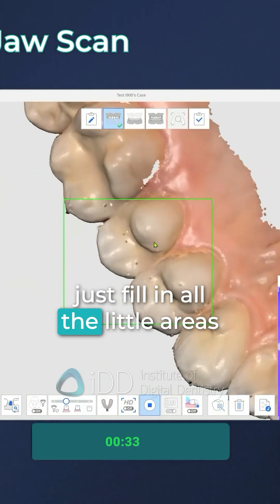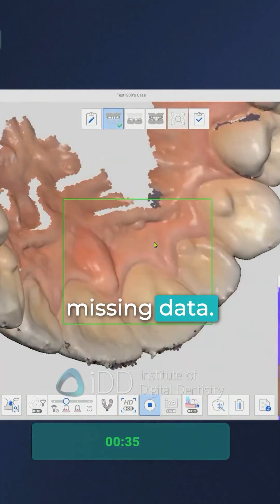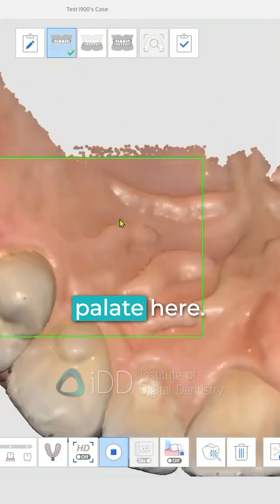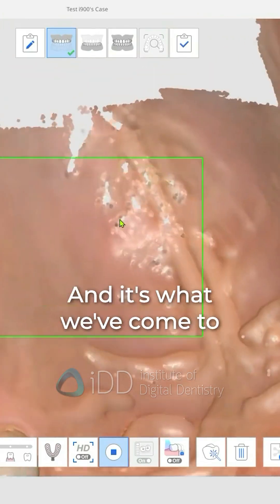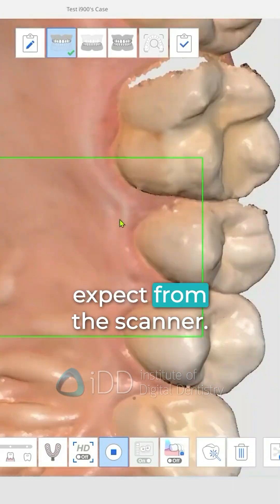We can also scan the palate here, and the Medit i900 handles this very well. It's very easy, and it's what we've come to expect from the scanner.